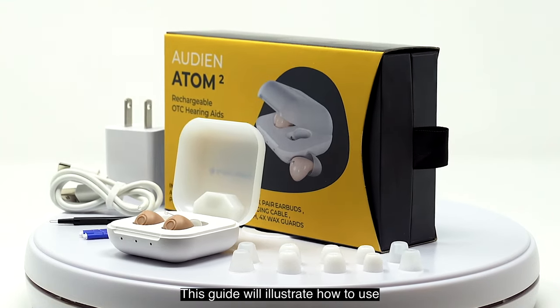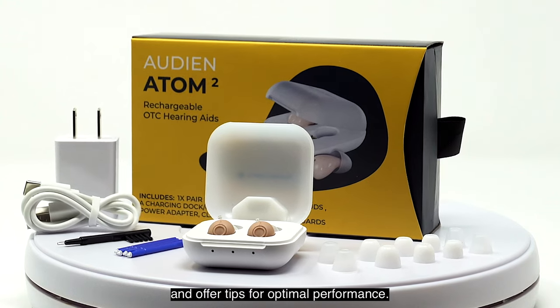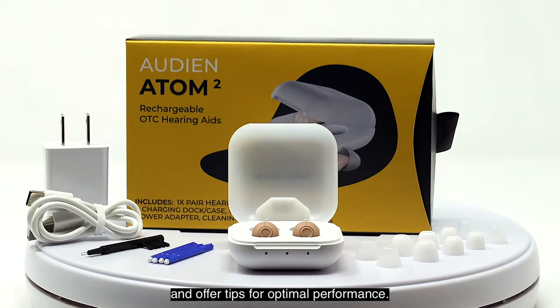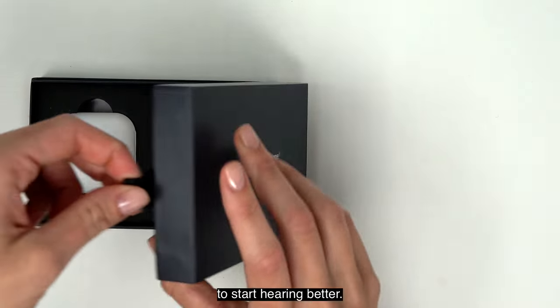This guide will illustrate how to use and maintain your Audien Atom 2 and offer tips for optimal performance. Inside the box, you'll find everything you need to start hearing better.